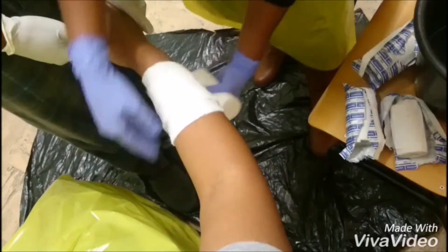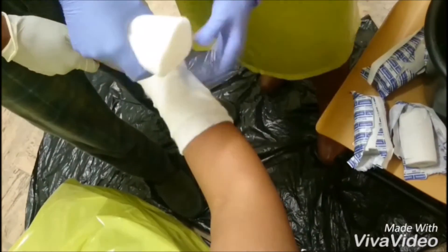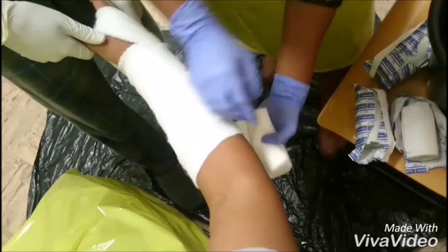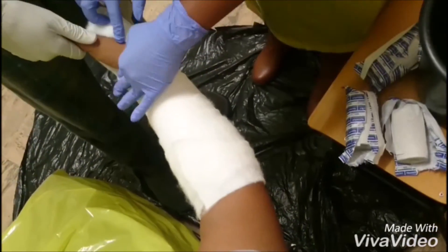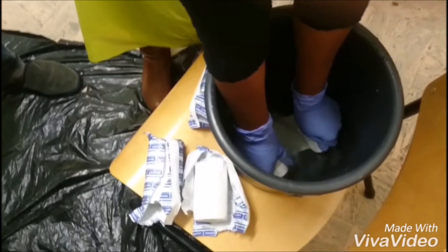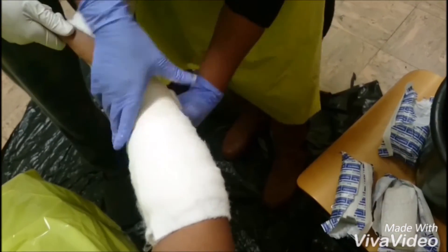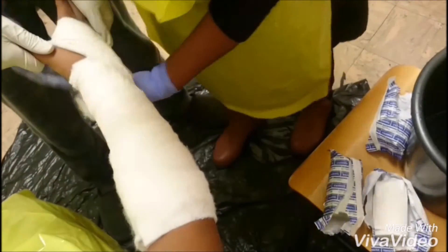To apply the POP, unroll the padding circumferentially around the limb to cover the area below the elbow that will be under the plaster. When applying the padding, there must be 50% overlap of the padding and make sure that all the bony prominences are covered well. Immerse the first roll of Plaster of Paris in water and hold it until the bubbles disappear. Drain it until it stops dripping but do not wring it out. Apply the first layer of plaster circumferentially around the limb, starting distally and progressing proximally, making sure that the plaster layer also has 50% overlap.